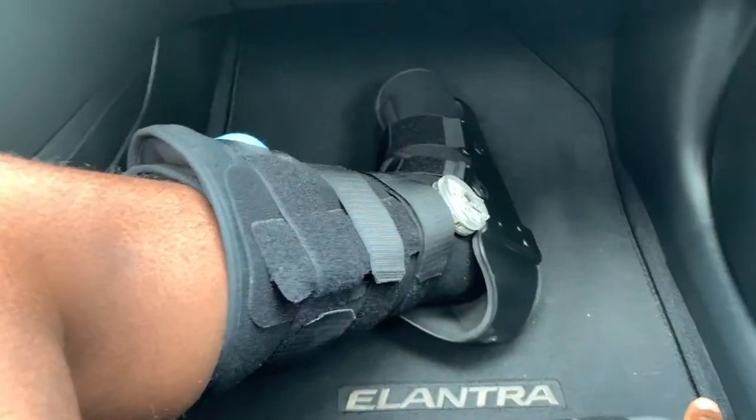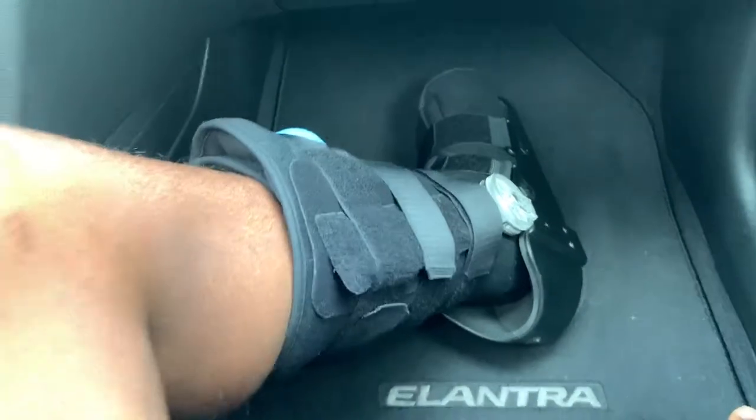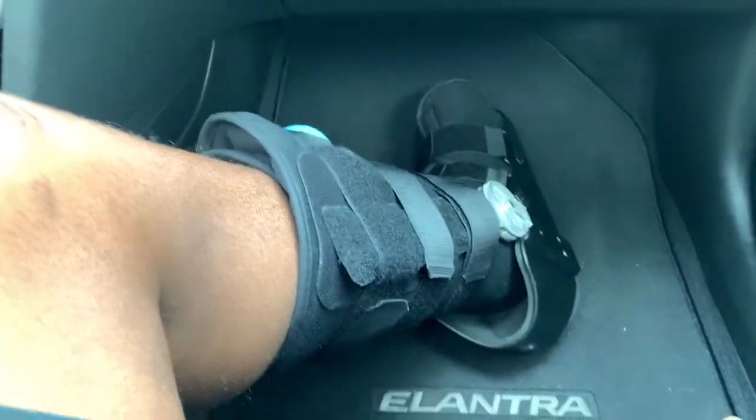So I got the boot. Today's Christmas, so Merry Christmas to everybody. I got the boot last Saturday — it came in. So I'm going to show you guys what it looks like. This is the boot right here. It's made by United Ortho on Amazon. You can find them on there. They come in a small and a large, or a regular and a large — something like that. And I got the large.